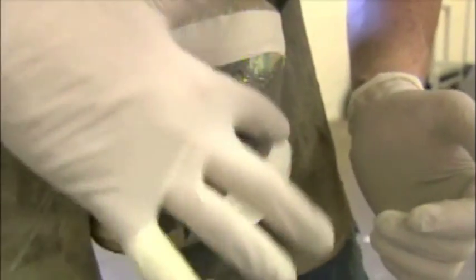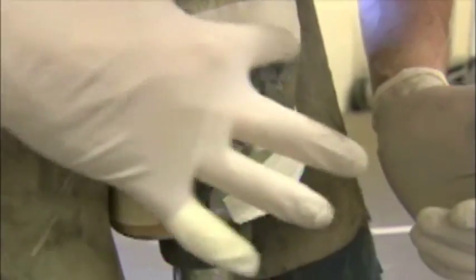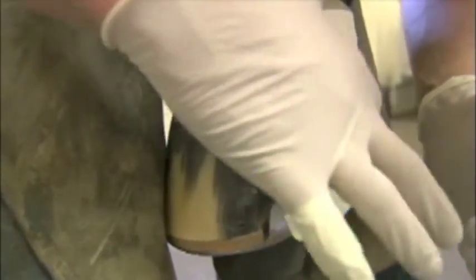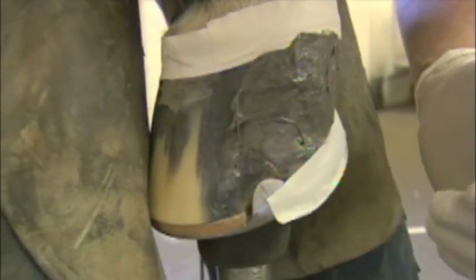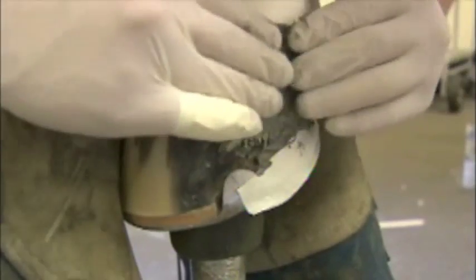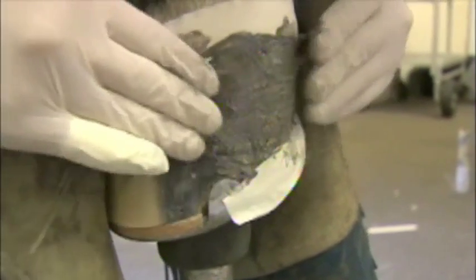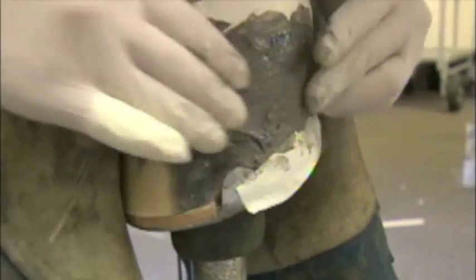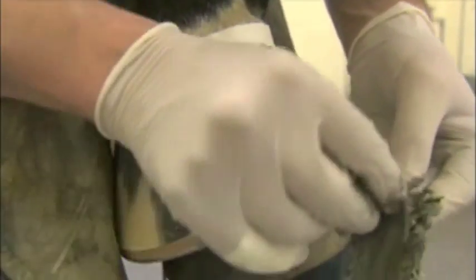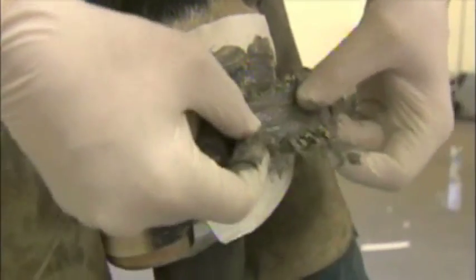I'll take a little bit of Equilox and just smear it across the crack. Then I'll take one strip that's been covered in Equilox and just bridge it across the crack. Sometimes these strips want to stretch out when you go to pull them — if that happens, you can just fold them over to make them thicker.